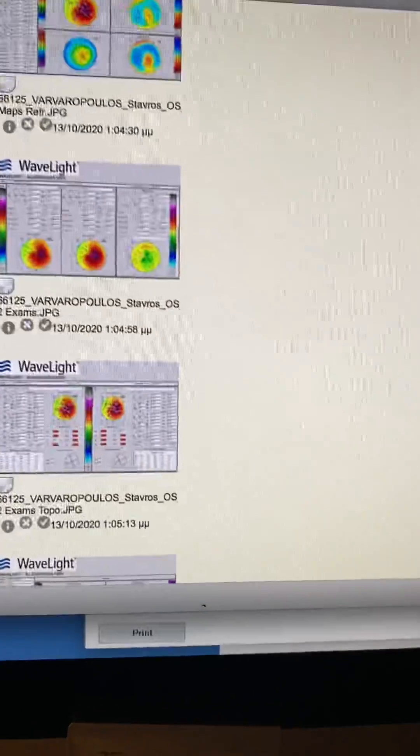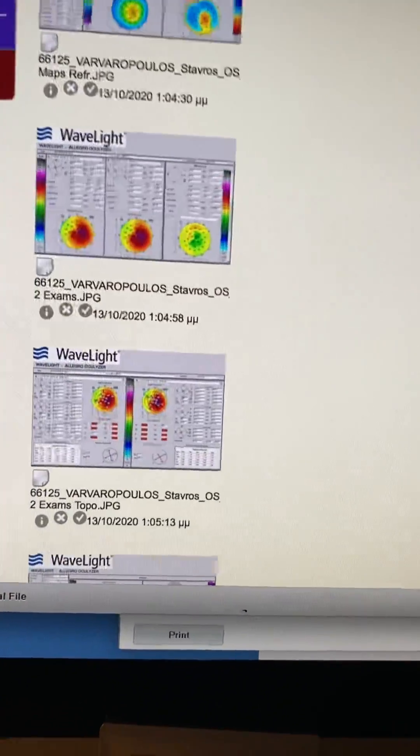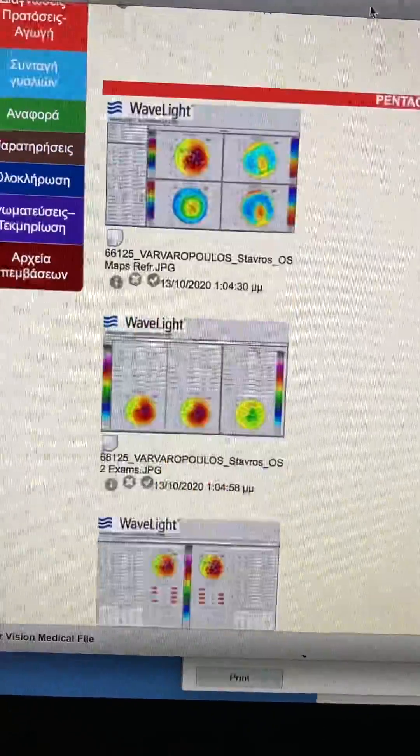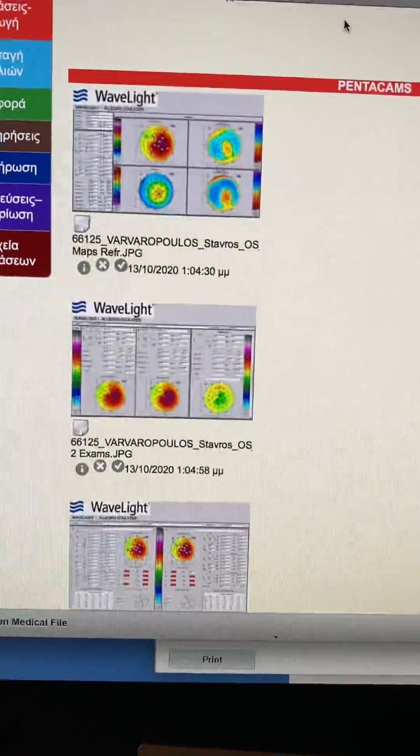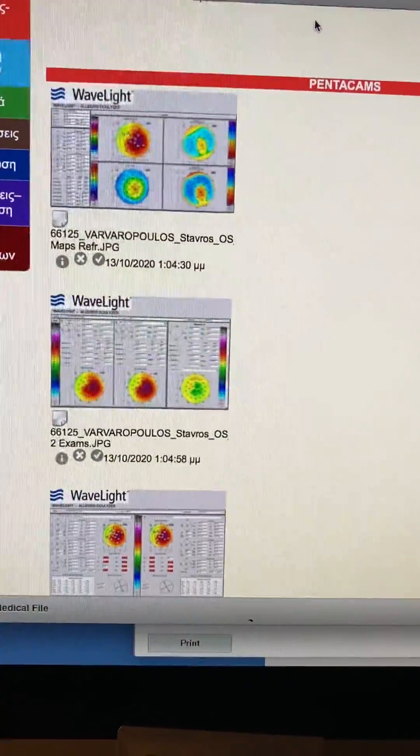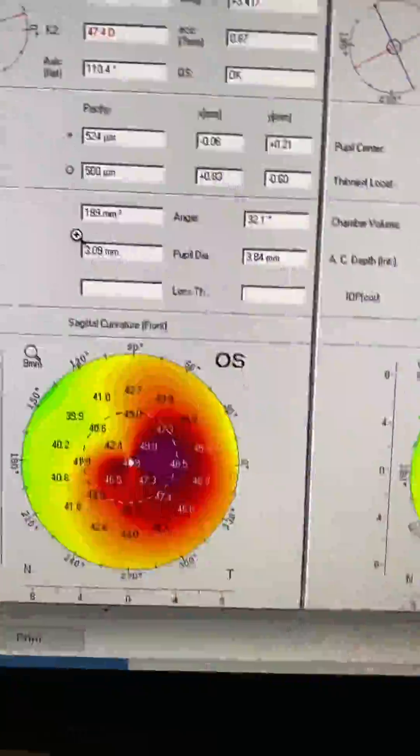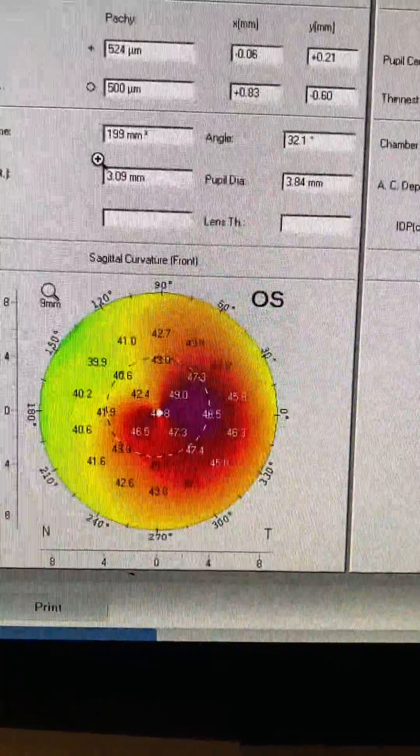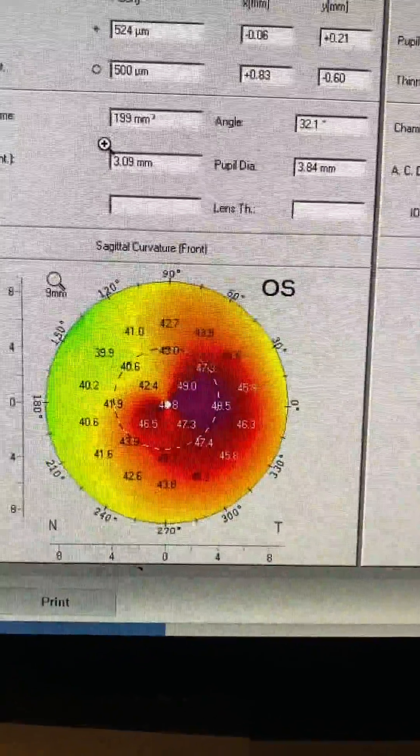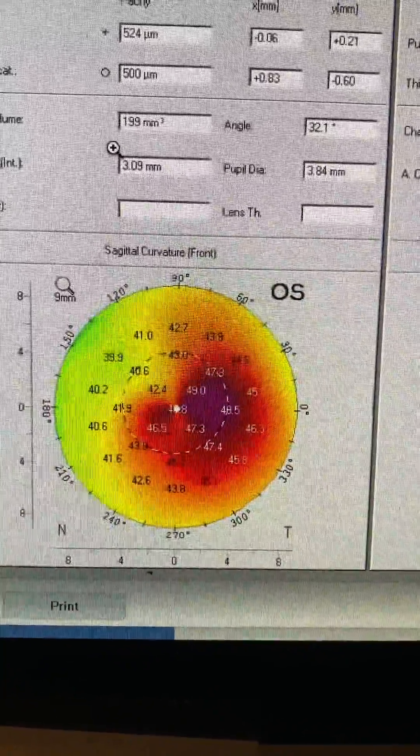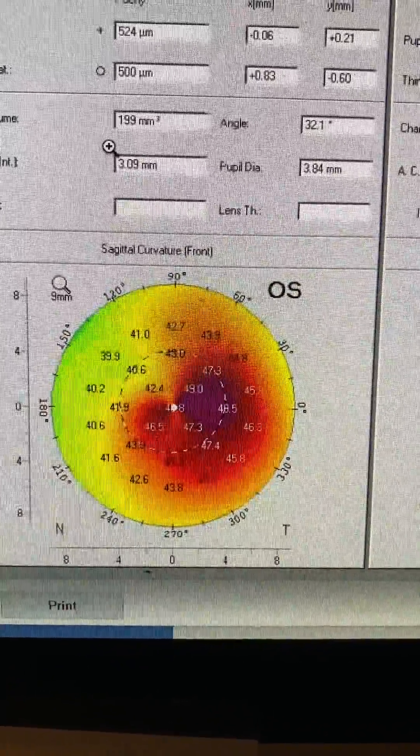We're going to look at a gentleman, well we can call him young, but he's 44. And obviously he has keratoconus.